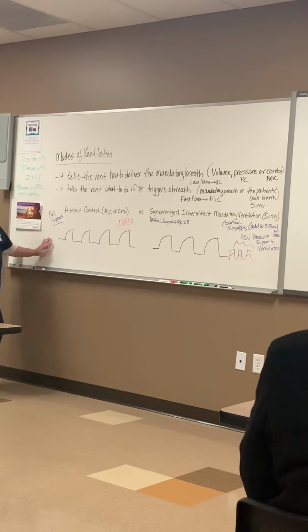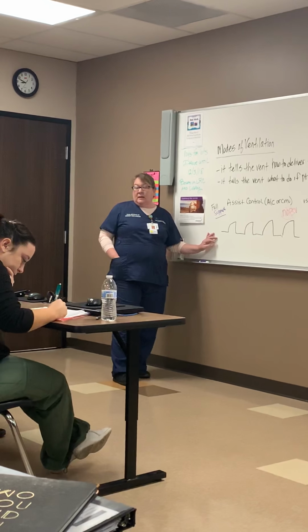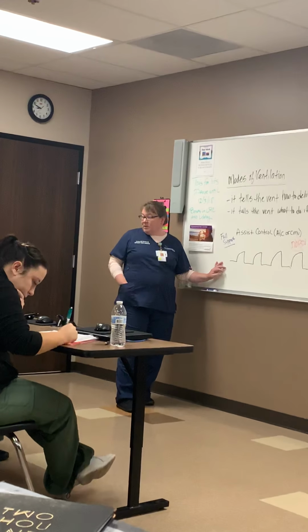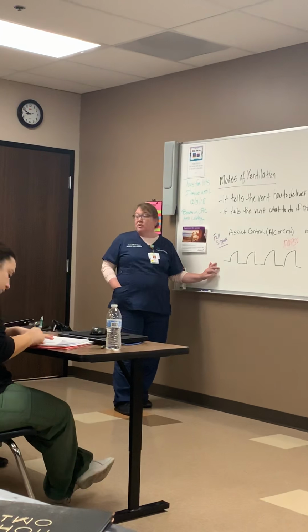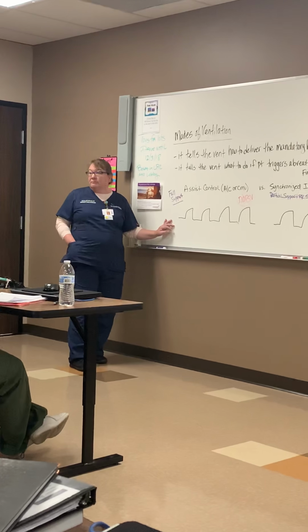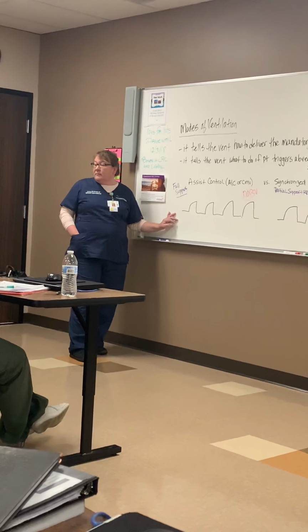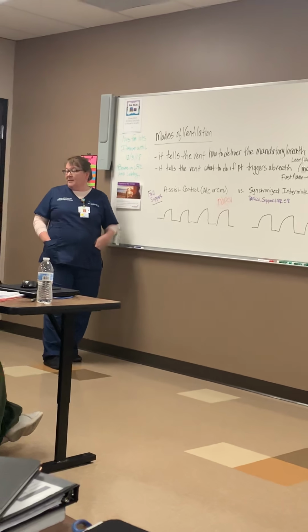Okay, are there any questions on this part? All right, you have a question? So there's no such thing as spontaneous breathing on a ventilator? No, there is, but it would be with no pressure support. If you put your patient just on CPAP of 5, that's spontaneous, because you just have that holding pressure and they're still doing all the work. You're not affecting their volume at all.